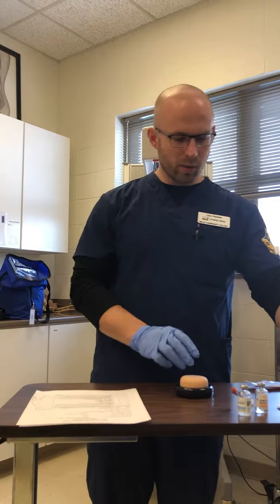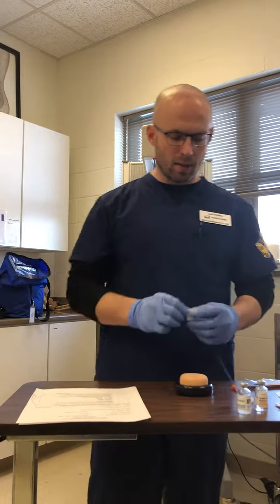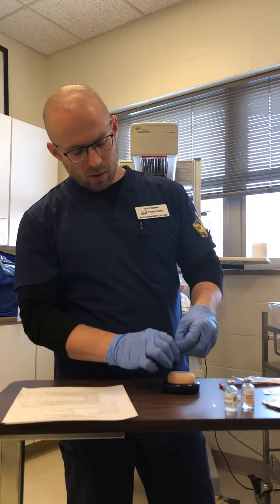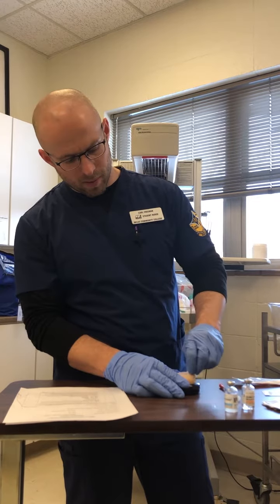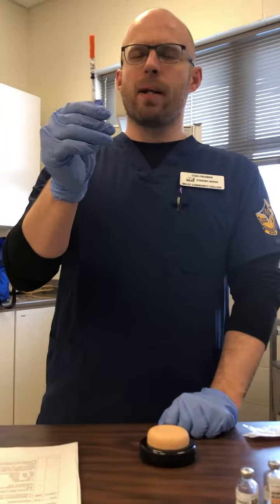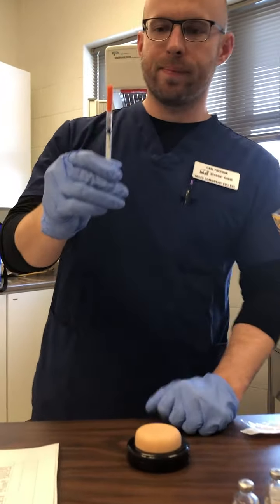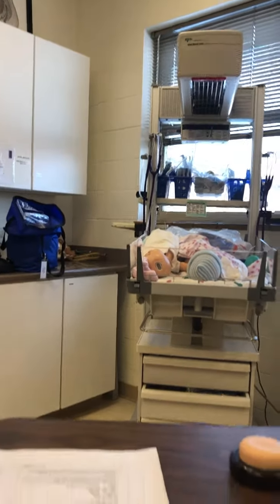The patient has asked that the injection be put into the lower left-hand quadrant of his stomach, so we're going to comply with that. We're going to take an alcohol swab, and we are going to start with small circles and bring them outward, making sure that the site is clean. Now I have prepared this dose of medication, but I need to verify it with another nurse. That is correct.